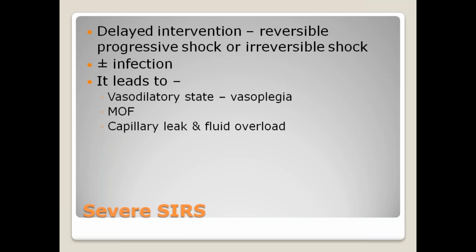And this is what you are going to get in each and every step when you do an ECMO. And that's the reason your balance is most important. Whenever you do ECMO, there will be many dilemmas. Whether to go up on the flow, because when I discuss hypoxia, I tell you methods of improving the hypoxia. You can cool the patient, you can increase the flow, you can increase the hemoglobin. So what to do at what time, that is most important. And your correct decision is going to help you to be successful.